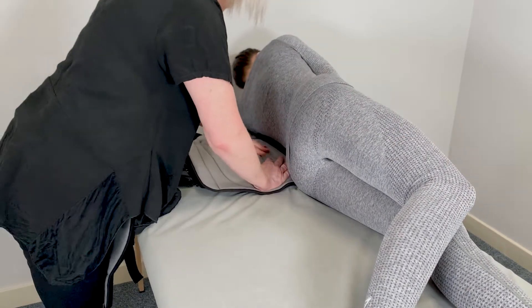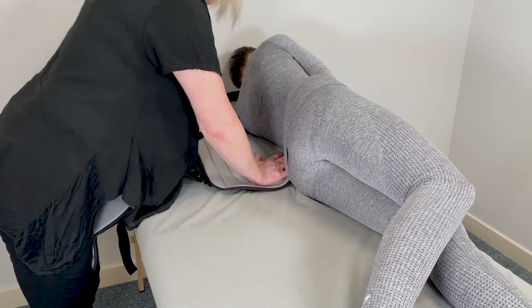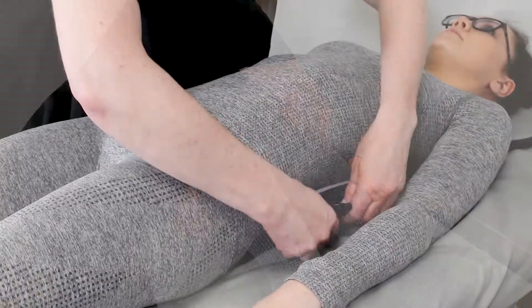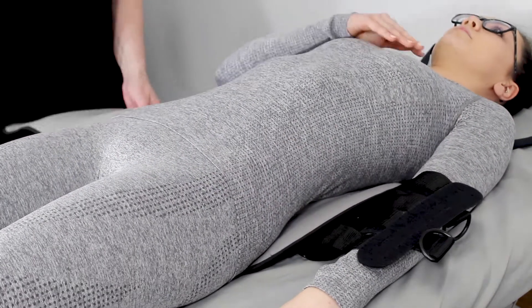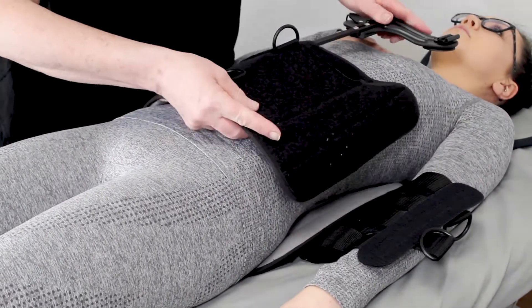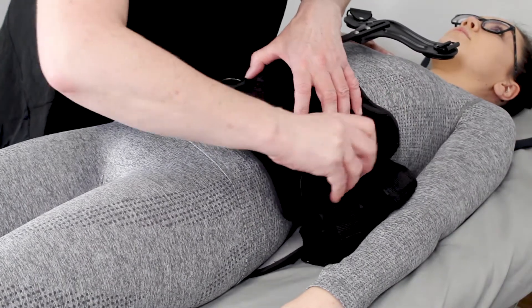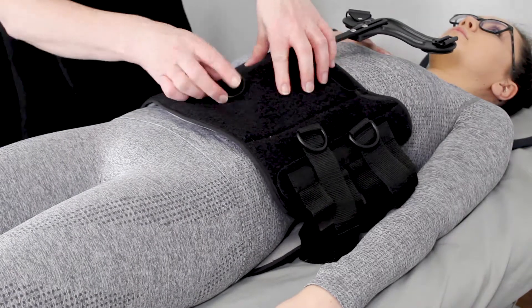Following your trust moving and handling policies, log roll your patient to the preferred side. Open the brace, compress the bed down, and slide the left or right side of the brace under the patient until the centre of the back panel is in line with the centre of the spine. Roll the patient back and make any necessary adjustments to ensure the brace is fitted centrally.